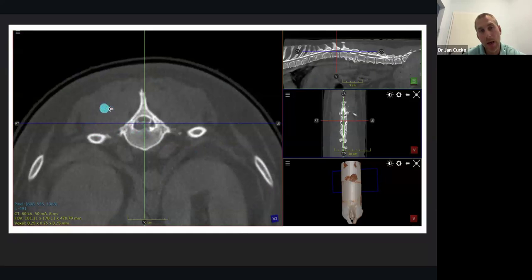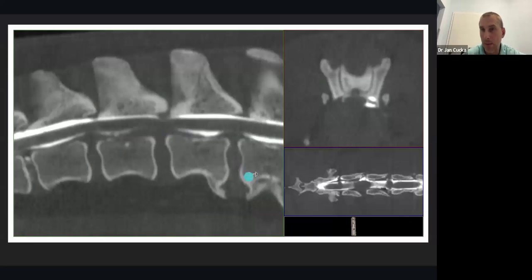So we perform a right-sided hemilaminectomy and take out this extruded disc material, and that was done. So also the hole on the bottom of the spine. We just see on the computer 3 axes, and we know what we are looking for.